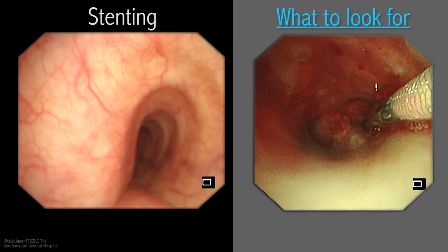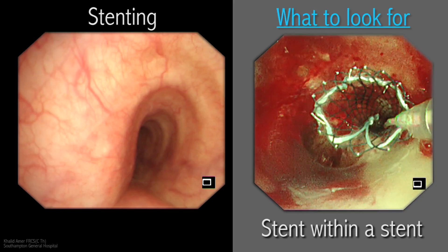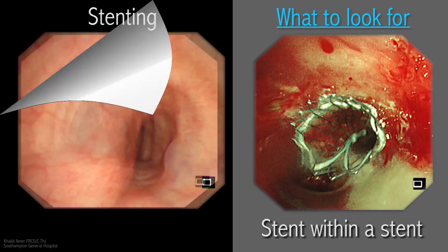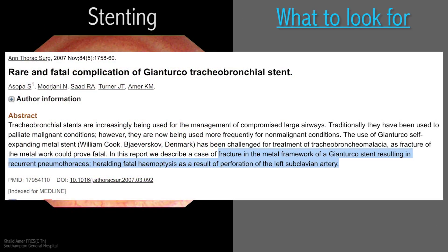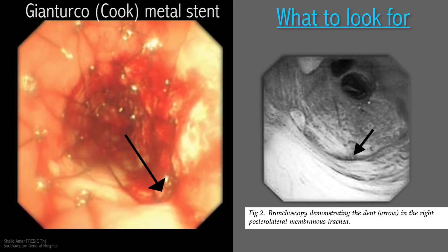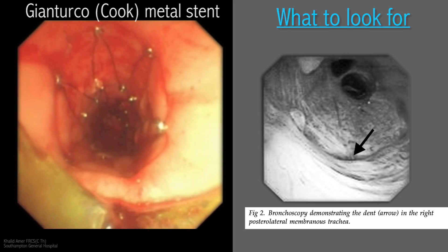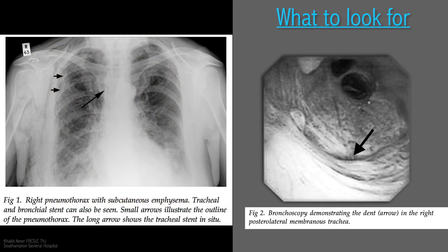It is possible sometimes to launch a second stent of a different type through a previously inserted stent, as shown in this clip. It is worthwhile mentioning that our early stenting experience at Southampton General Hospital involved the Gianturco metal stent, made by William Cook, which was popular at that time. We no longer use them. We have previously reported fracture of the metal framework of a Gianturco stent resulting in recurrent pneumothoraces, heralding fatal haemoptysis as a result of perforation of the left subclavian artery.